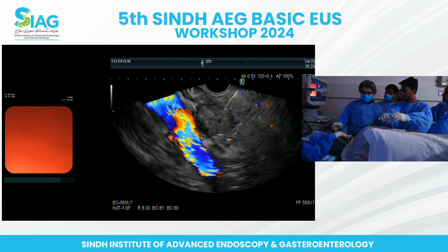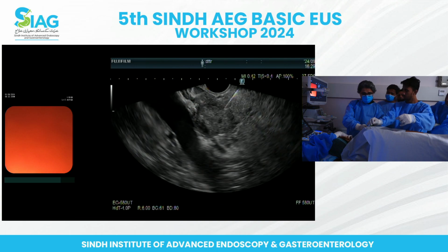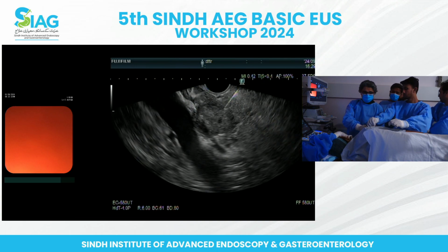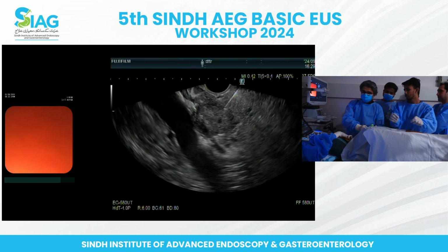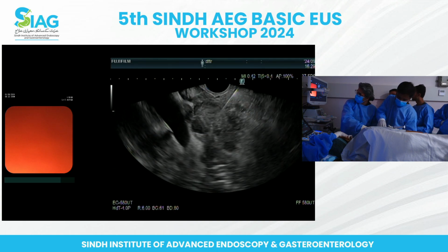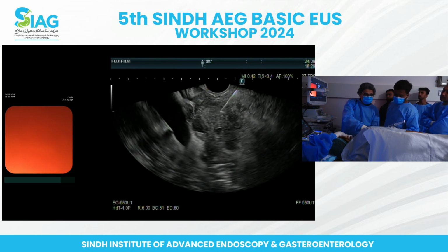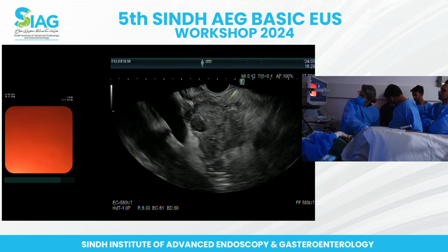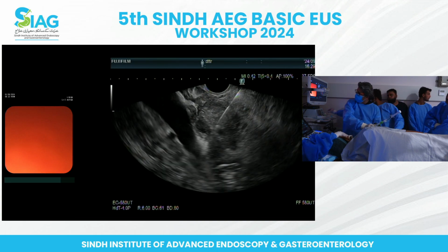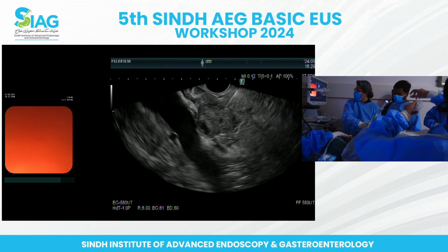So the capillary technique, which we don't use much, but if you want to use it, there has to be coordination. The goal is to create a vacuum there. So when the needle goes in, the stylet should be getting pulled out. There's no point pulling the stylet when the needle is coming back. So the more I go creating there, I get a better sample. I might miss the needle direction a little, but again, we're just going from.